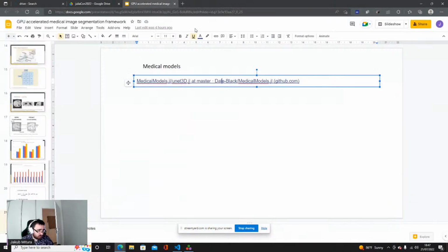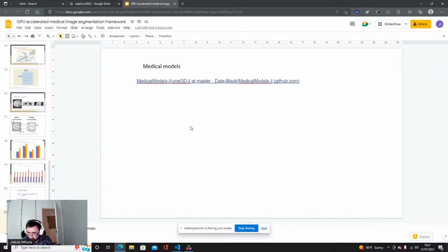Basically, I used these for U-Nets and for a lot of other things. They are very useful to look at if you are interested in this topic, and they play well with my tools also. So you can choose whatever you want and compose whatever you like. This is the strength of Julia, and I wanted to keep it like that.